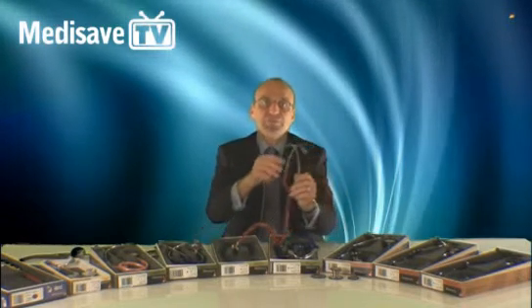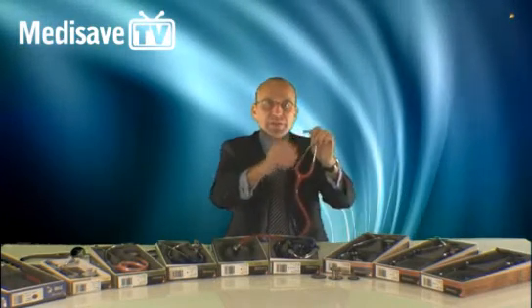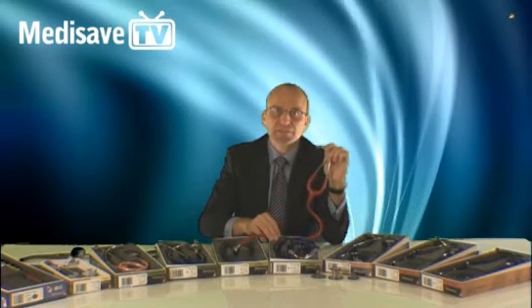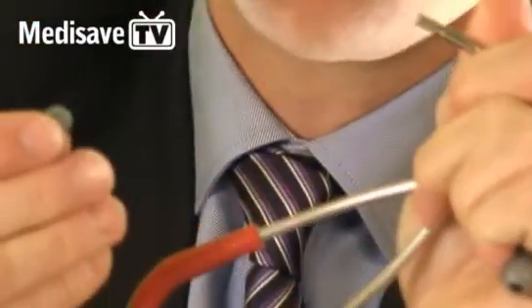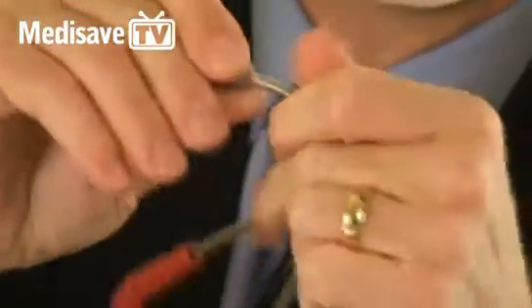Stethoscope performance also depends on an airtight system from patient to ear. Littman eartips are a patented device called snap-tight eartips. These are designed to provide excellent comfort and a totally airtight seal. They snap on and off for ease of replacement, and new eartips can be purchased online from Medisave in both large and small sizes.